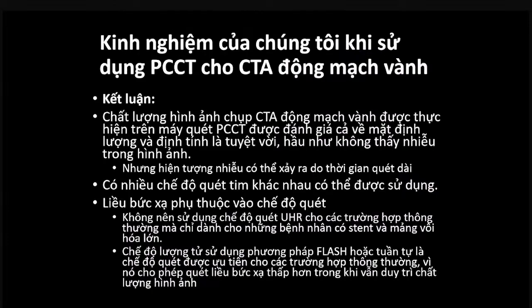So our experience with using PCCT scanners is image quality of coronary CTA scans performed on PCCT scanner, assessed both quantitative and qualitative, is excellent, with almost no noise seen in the images. The problem is that artifacts can occur because of the long scan time of 8 to 12 seconds, and this is a major issue for us, where there can be breathing artifacts and other artifacts.